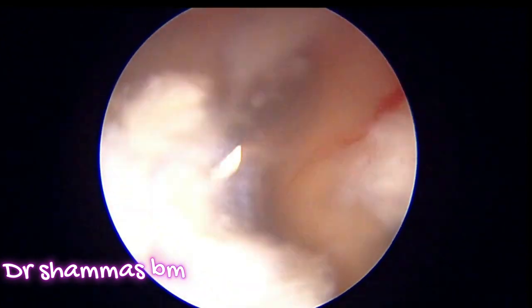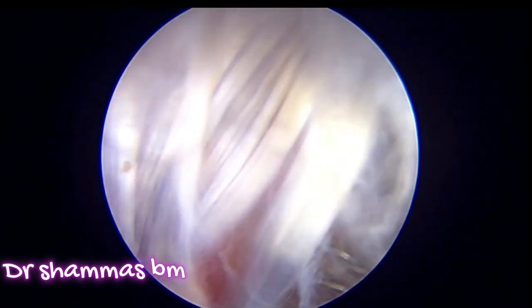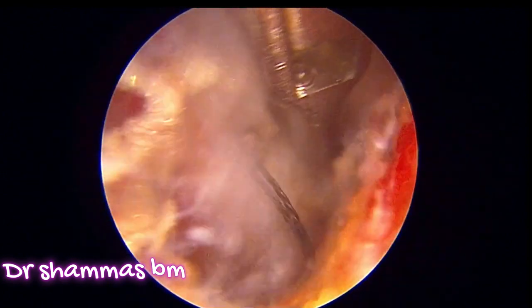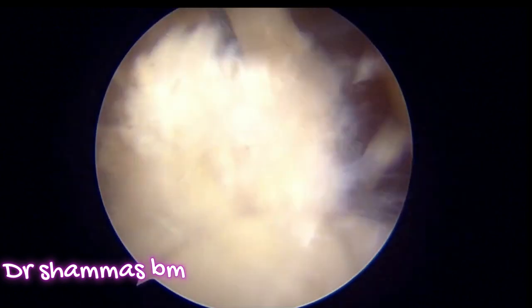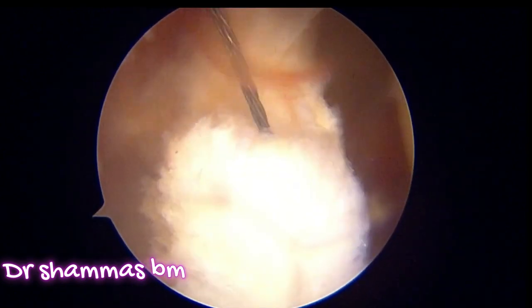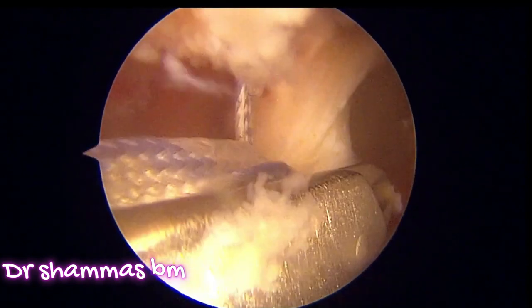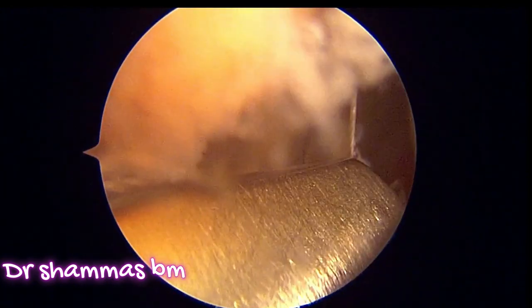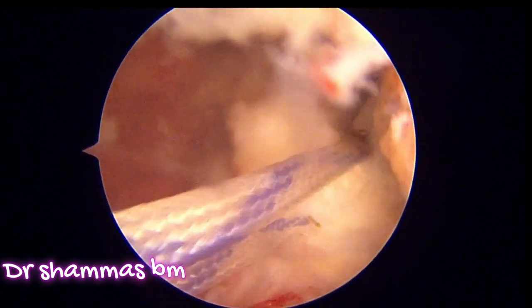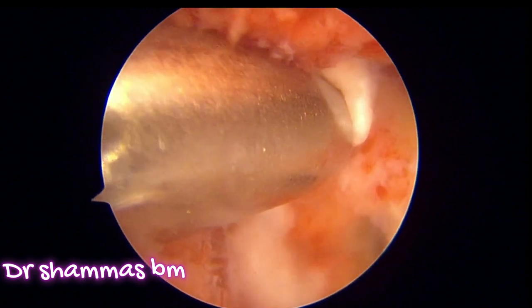Here I am using a lasso, coming from inside the joint and passing a loop across the labrum. This is the nitinol wire that has come outside. You take the nitinol wire out and shuttle it with a suture tape. The suture tape is coming inside. I have taken it from inside out — that is, from inside the joint to outside. You can go the reverse, but there is a chance of damaging the cartilage. Now I have taken the two limbs of the suture tape through one portal and am passing the pilot hole for the nautilus anchor.